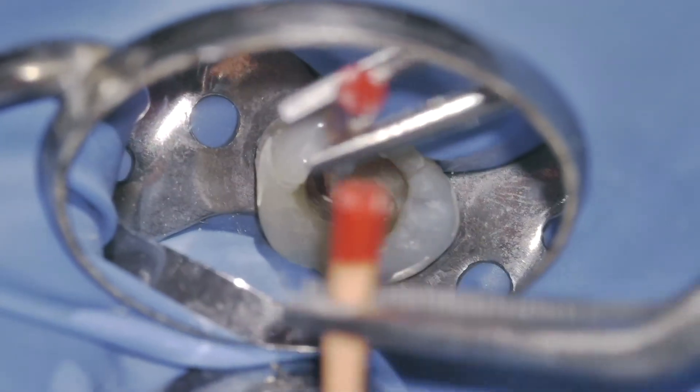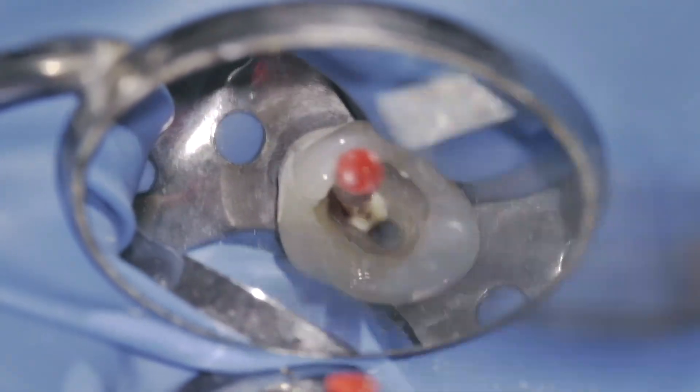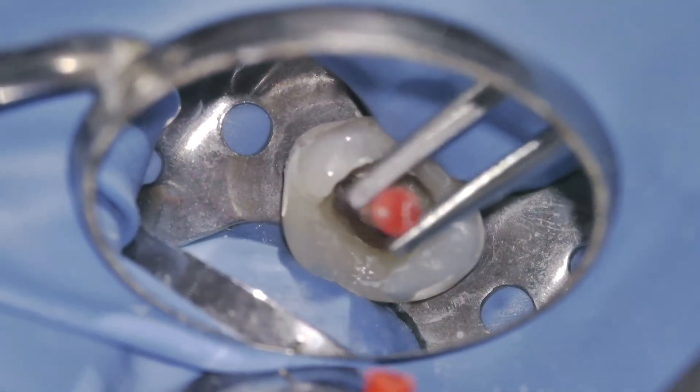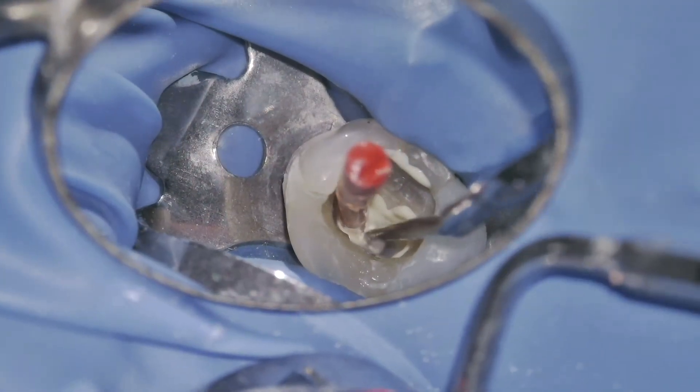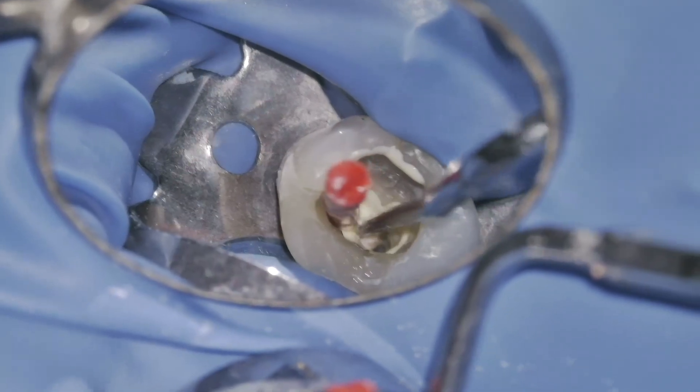After cleaning and shaping, I'm ready for obturation. I'm using a warm vertical compaction technique with the AH Plus sealer. This approach allows me to create a dense seal within the root canal system.